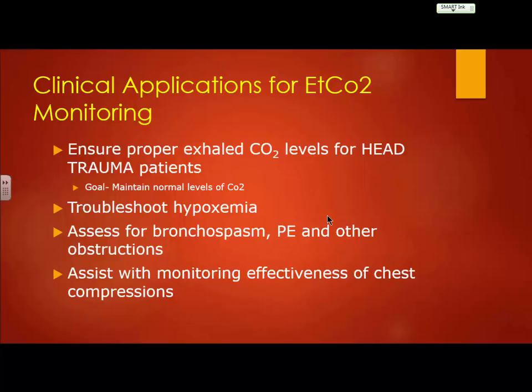I like to reinforce that, even with cardiac monitoring, you treat your patient, right? You treat the monitor too, all right? So that's not 100% accurate, treat the patient, not the monitor, because your monitor tells you a lot. But you've got to have your clinical assessment, your clinical application to what you see here, and if you can correlate the two together, then yeah, if I've got that patient with a history of asthma and all that, and then I see a rapid rate with that shark fin, there you go. You know what I mean?